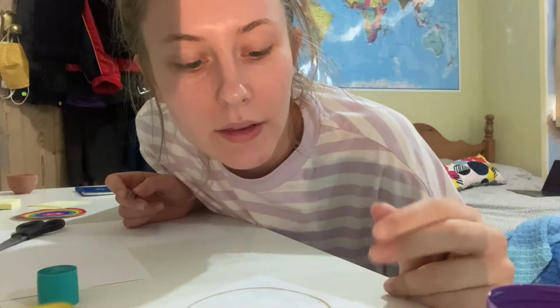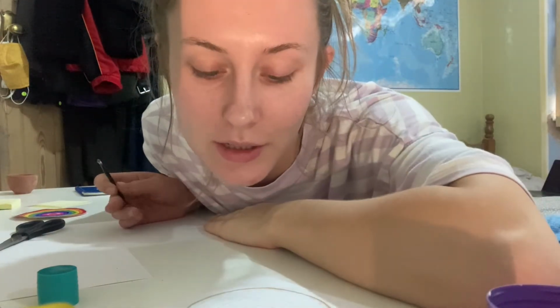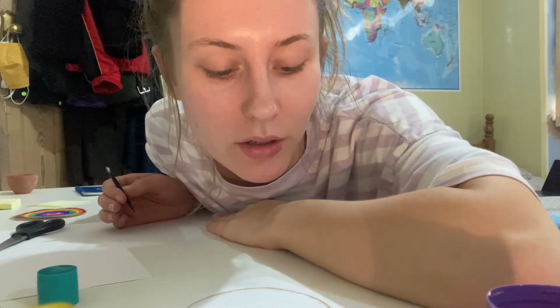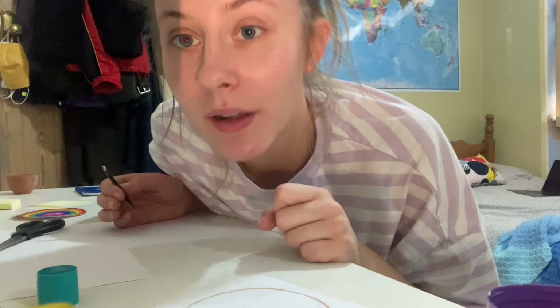So what I'm going to do is let that dry a little bit, and then I'm going to move on to the inner circles. And basically, it takes less time as you go because it's a smaller circle each time. So although the first one might feel like it's taking forever, once you get that done, it's not too bad. So yeah, I'm going to just do that for all of them, and then I'll get back to you when it's finished.